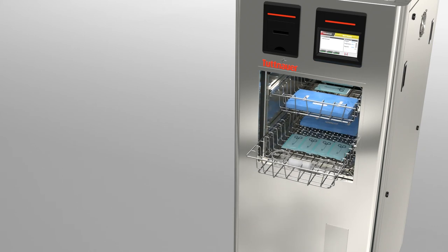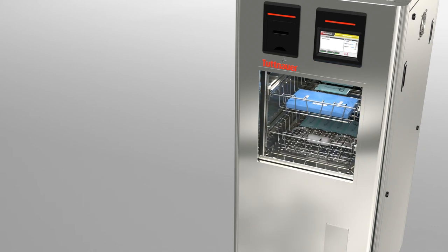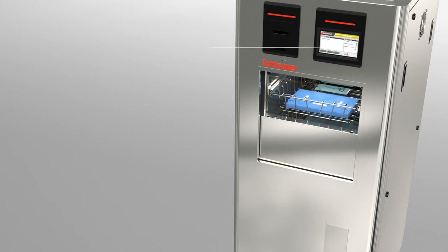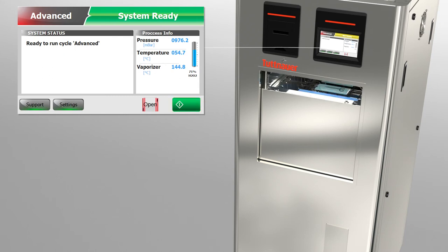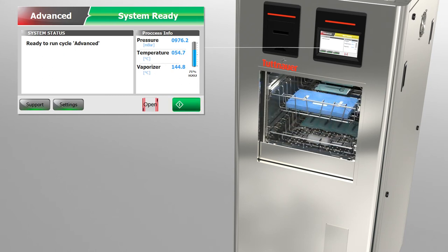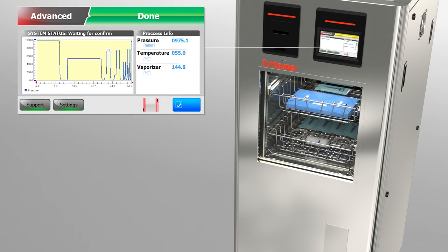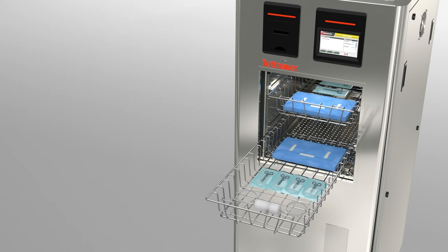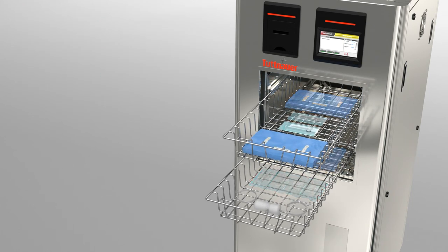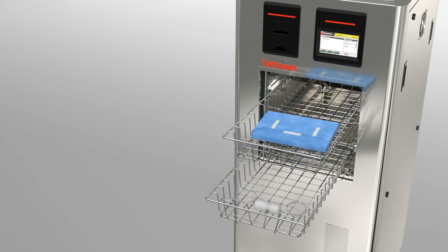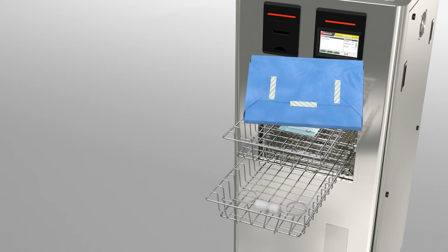The Plasmax door is closed and the relevant sterilization program is initiated. At the end of the sterilization process, the treated load is removed.